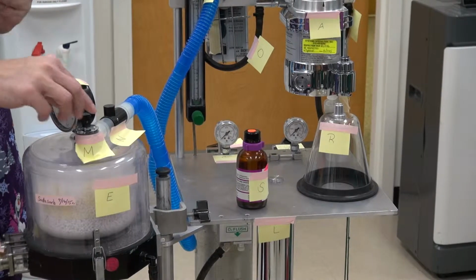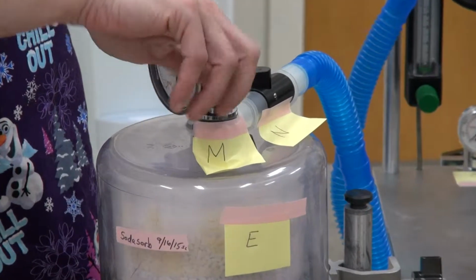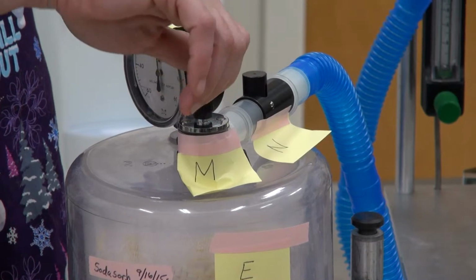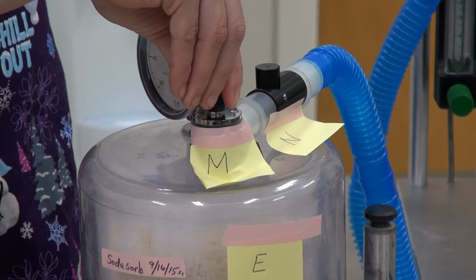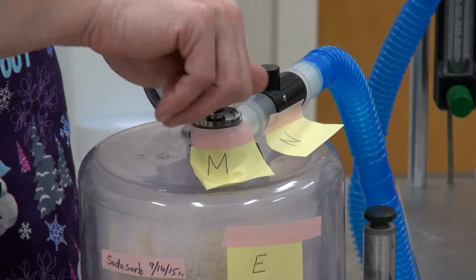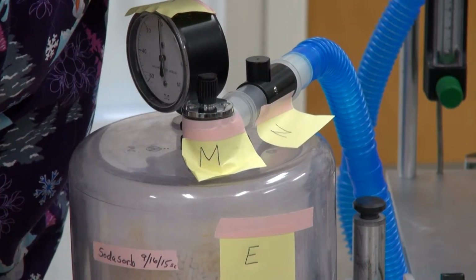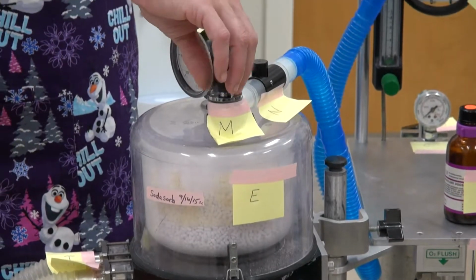What's this? It's our pop-off valve. Righty tighty, lefty loosey. What do we always have our pop-off valve? Open. Always open, okay? We do close it if we need to give our patient a nice breath, but we always want to remember that we need to reopen.